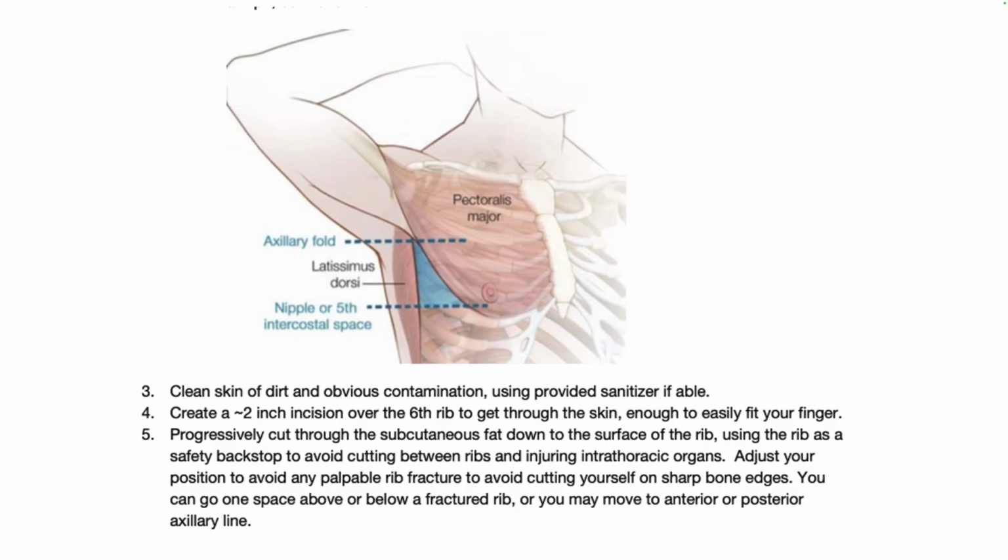And we're going to cut all the way down to make sure that we're through all those little soft tissue membranes until we can feel that we're right on that rib. Any of those little membranes are going to get in the way.